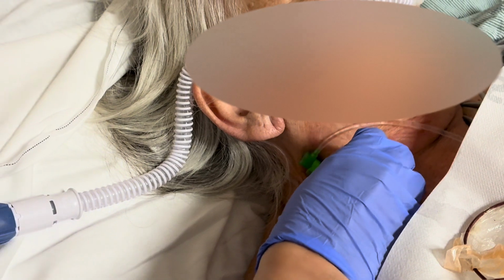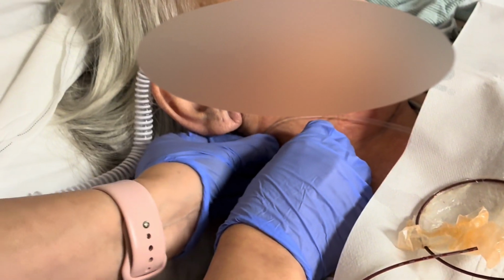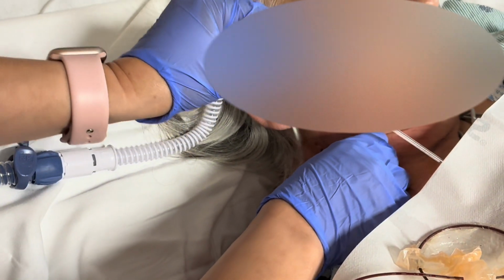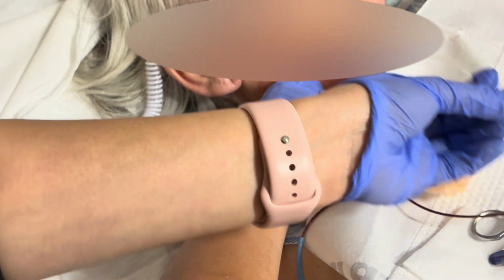So always put pressure here, especially since the patient was on thrombolytics, right? So I'm gonna lower this a little bit, and as I pull this out, I put pressure. All right, let's support this. There you go. So again, make sure that the tip is intact.